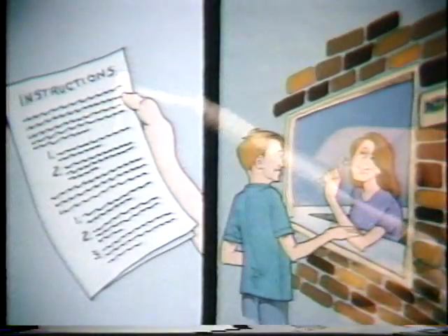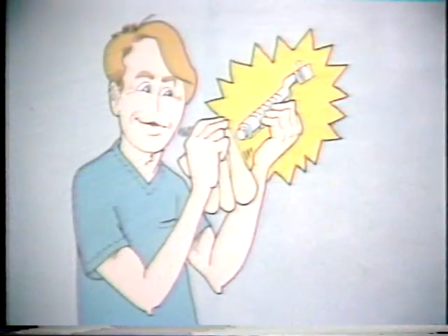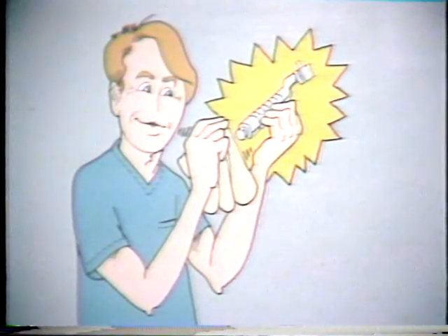If you need help with these maintenance procedures, please review the handout. If that doesn't answer your questions, go to the 2A or the 3A dispensary. Remember that the dispensary has loaner handpieces if your handpiece needs repair. 15 minutes a week of maintenance is certainly better than paying the consequences of having to repair or replace a damaged handpiece in terms of the time wasted and the expense.